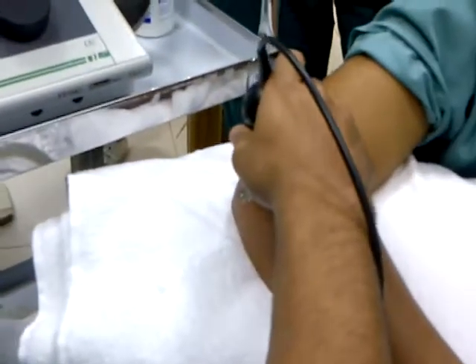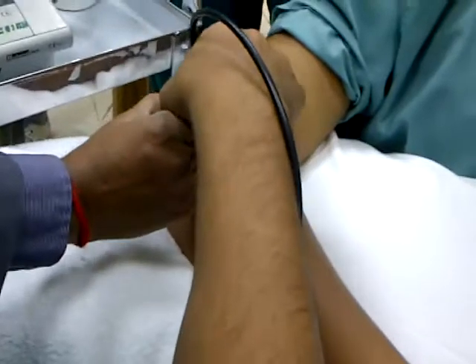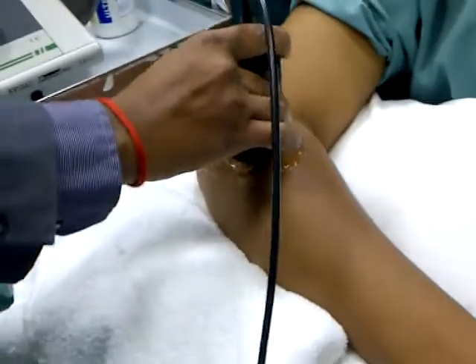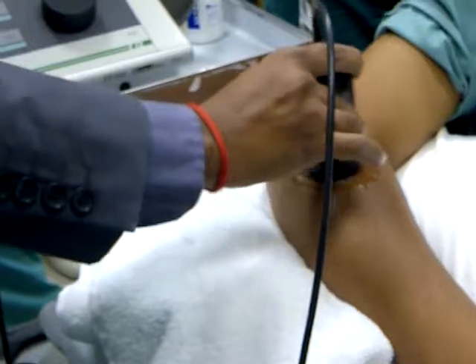But again it gives sound. That means what? No contact. I have to bring that. You have to maintain some pressure, firm contact. But again it still gives sound. Okay. There is no contact.